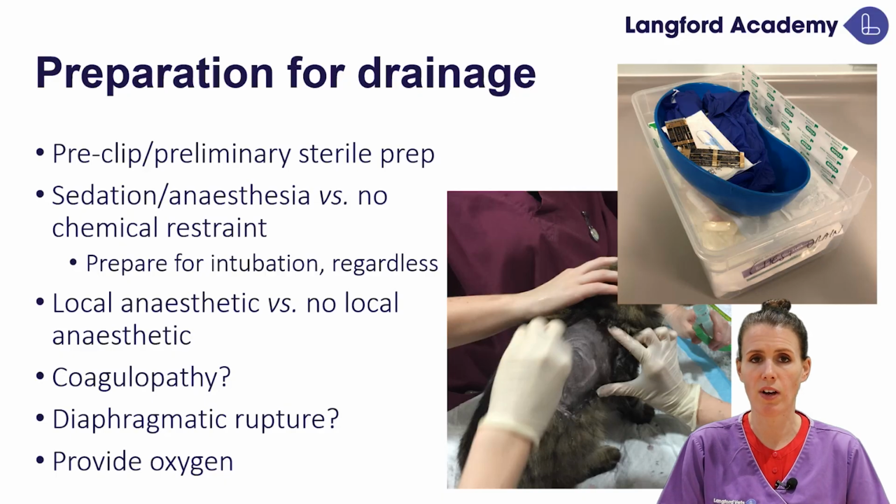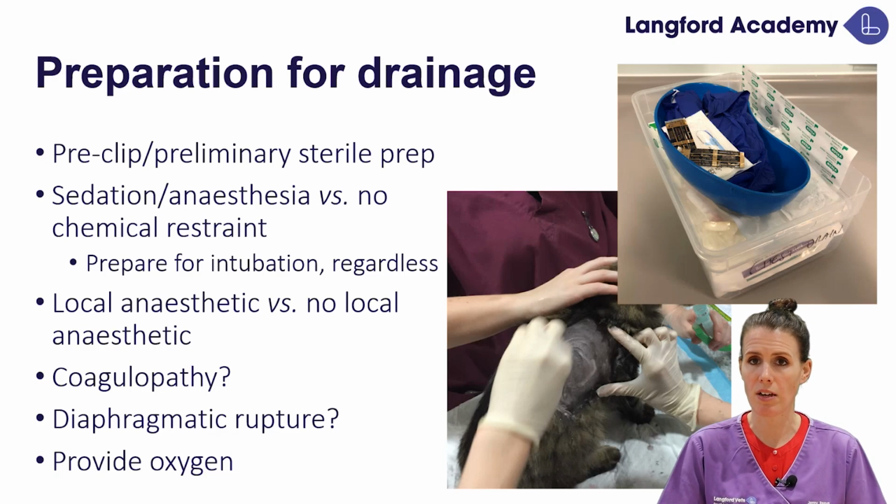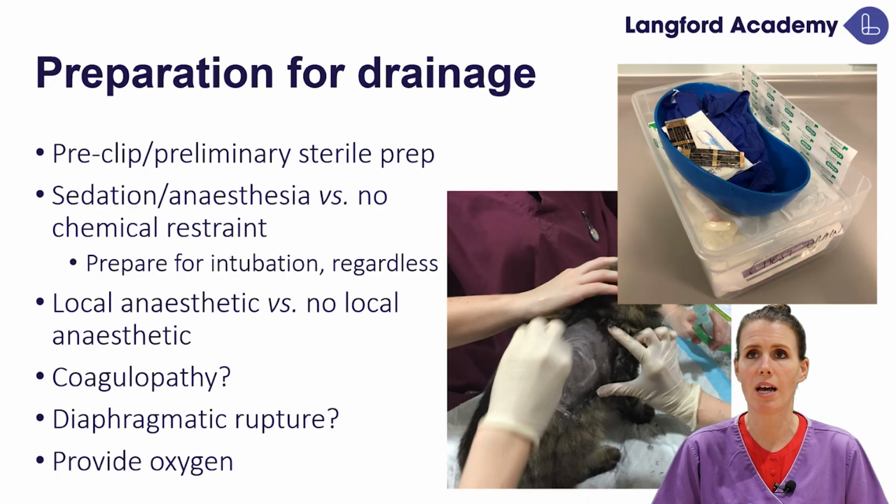got intubation kit available so that we can ventilate this patient if we need to. And often, if we've got respiratory compromise, then full anaesthesia is going to be safer than sedation. So we just need to consider all of the patient factors in that, but certainly have intubation kit ready so that we can provide ventilatory support as needed.